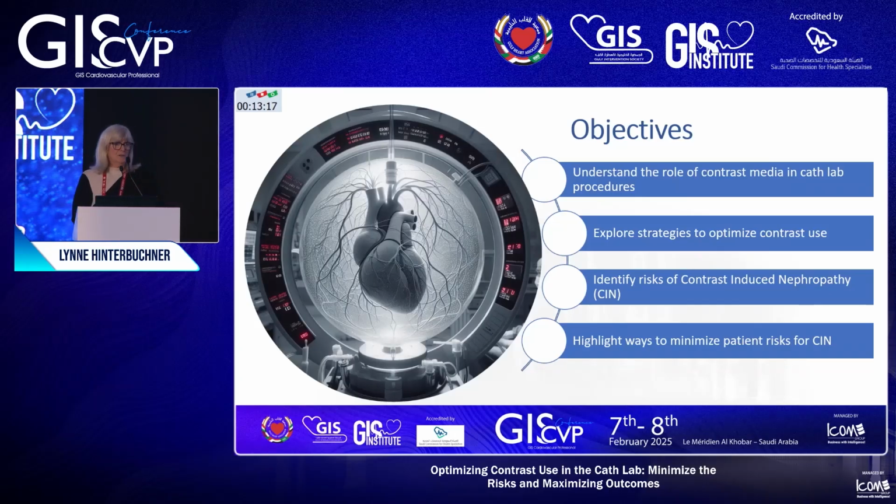We all know that we use the contrast in the cath lab. The reason we need to use it is because X-ray just isn't enough. You need the contrast to visualize your coronary arteries, the anatomy and physiology of what's happening within and how the circulation is going or not working in the coronary arteries.